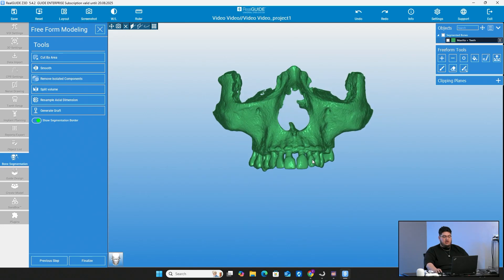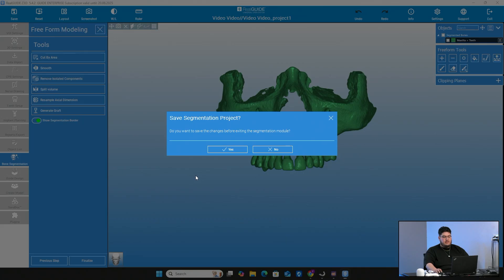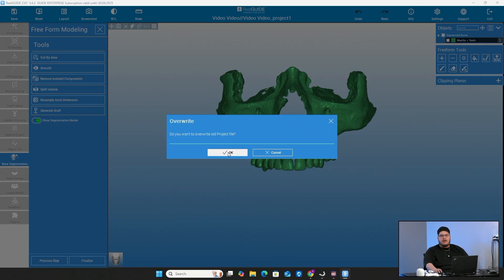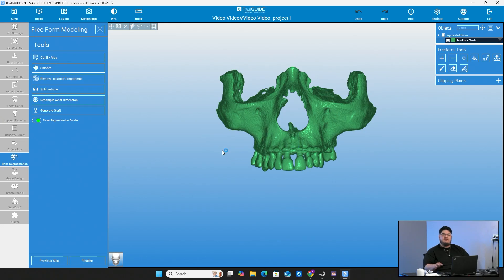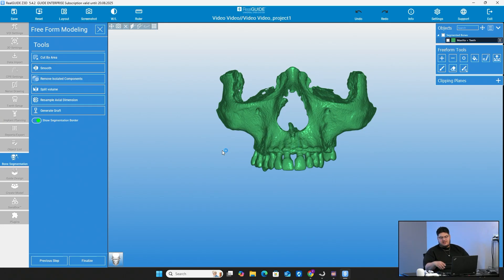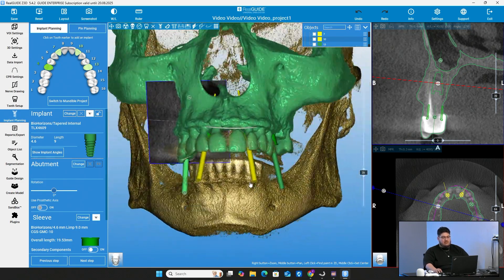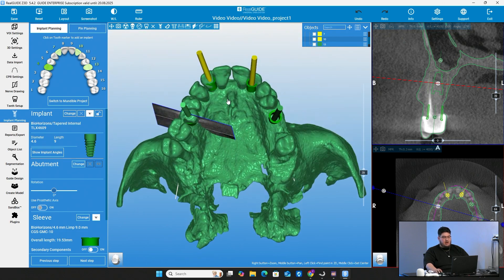Once we've done that, we're going to move forward. All we're going to do is go to the bottom left and press finalize. It's asking if you want to save the segmentation project — we'll go ahead and press OK. If you're going to overwrite a project, that's totally fine. If you don't want to overwrite something, just change the name. Now we have our segmented model just like that. We can even get rid of the CT scan for now and just look at our segmented model.